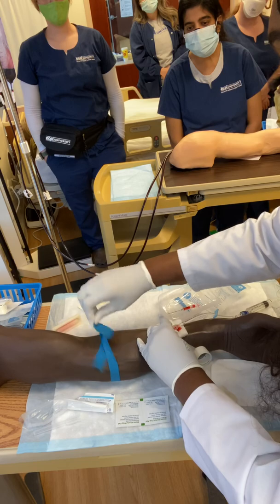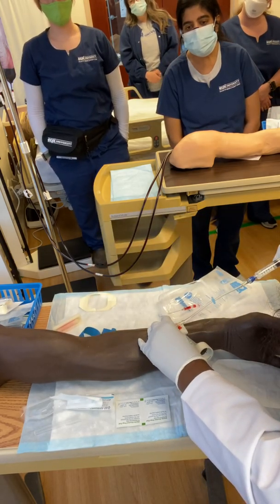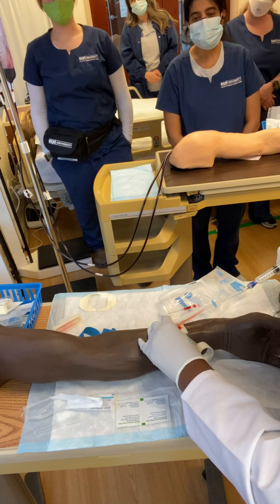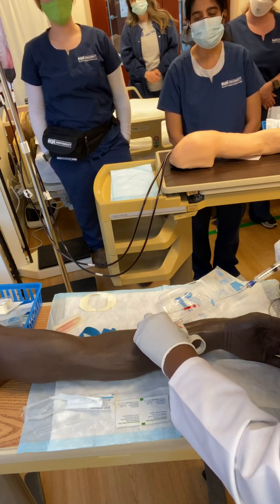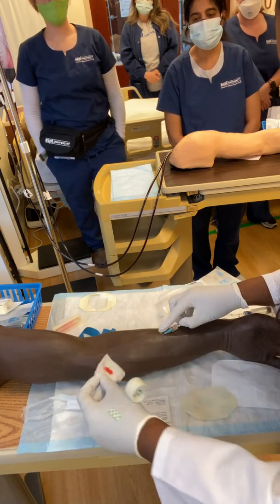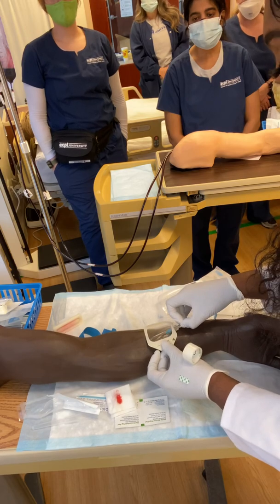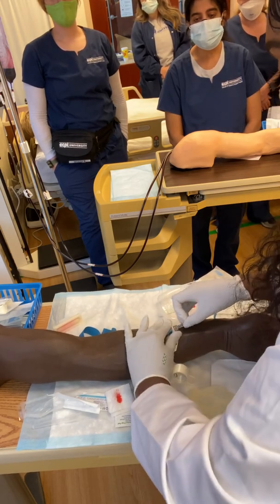We'll take off that tourniquet. And then we just flush. Okay? Because we already have that blood return right there and we're flushing. And then the only thing left to do, we're going to pretend that's in. And the only thing left to do is put our op site right over it, just like that.